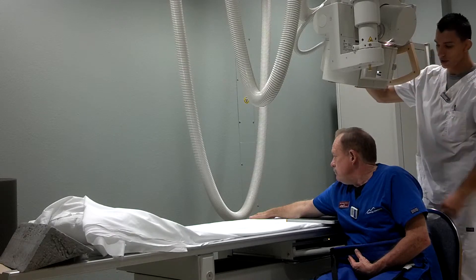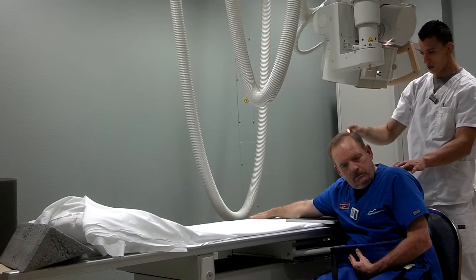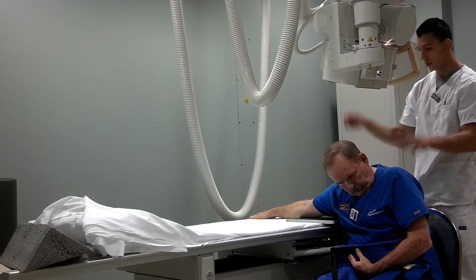And you're going to ask the patient: can you look away from your right side? Just look towards your left please, and duck your head a little bit. There we go. And that's out of the field.